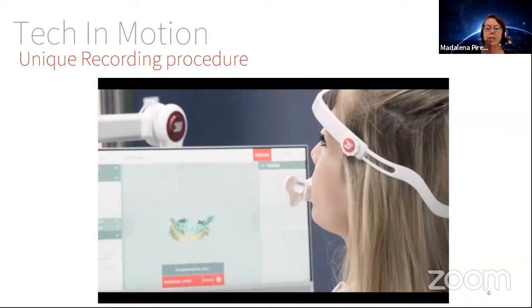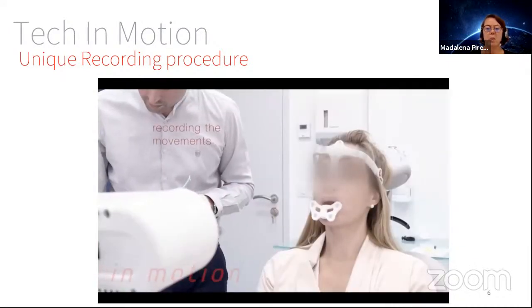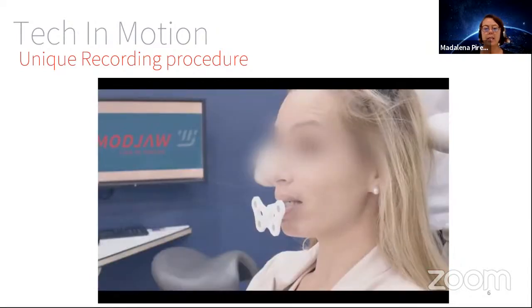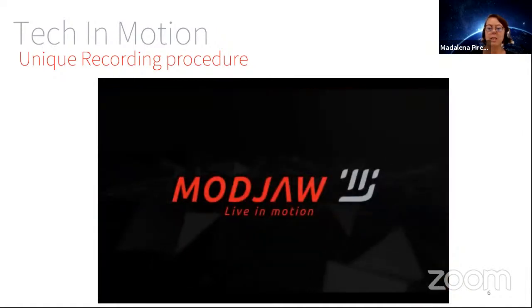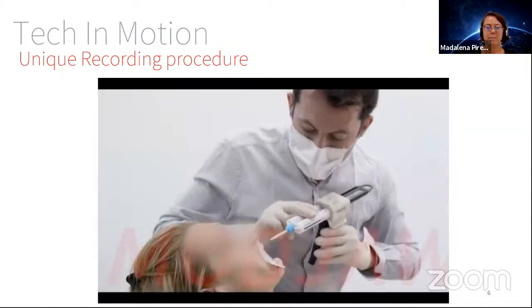Now the doctor is going to give the patient a little piece of apple to chew, and we're going to record the chewing cycles of the patient. And like this one, there's many other things we can record, like speech, etc. And this is data that we didn't have before, so it's very new, and it's a real plus in the digital process.